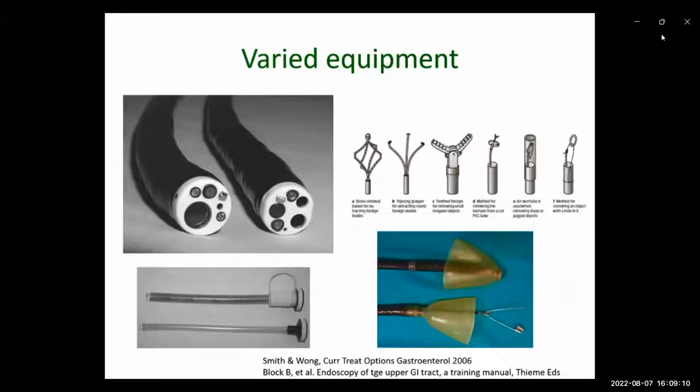You may also consider using a rigid pharyngoscope that has a larger working channel and a stronger grasp. Numerous retrieval devices are available. The chosen device will depend on the size and shape of the foreign body, but also on the length and operating channel width of the endoscope and the endoscopist's preference and habits.